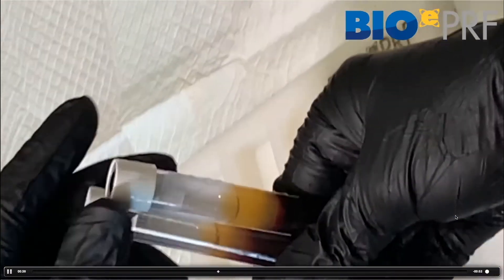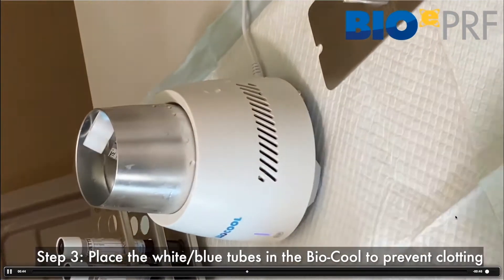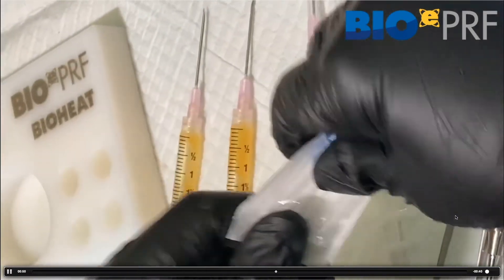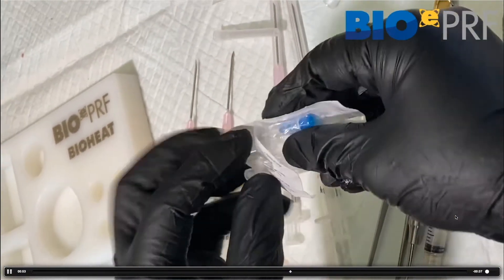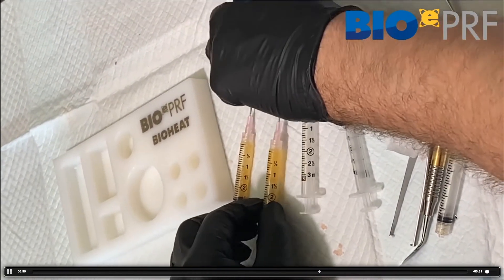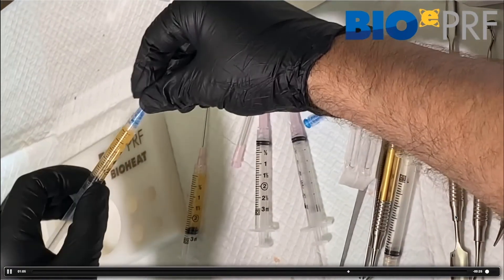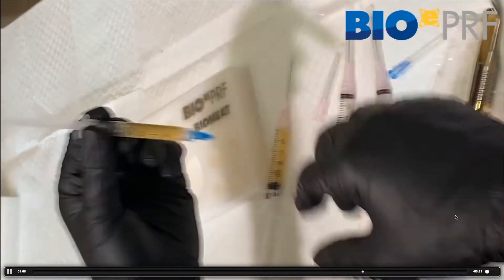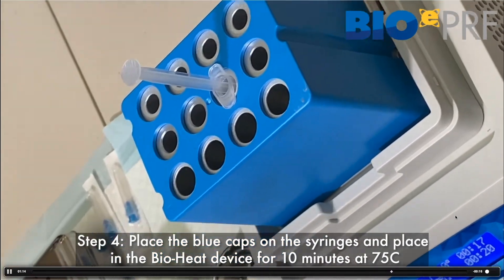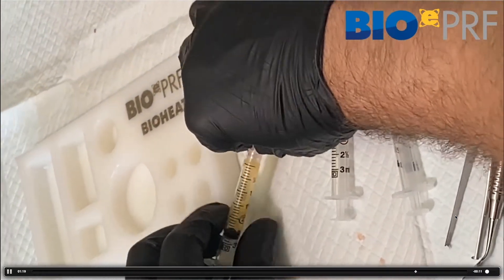Always remember that these two remaining tubes are then going to go into the bio cool, simply to extend the working properties of the liquid platelet-rich fibrin. The blue caps are meant to prevent the liquid PRF from soaking or running out into the bio heat device — once attached, the liquid cannot escape. We place that into the middle layer of the bio heat device, set at 75 degrees Celsius, and it runs for 10 minutes.